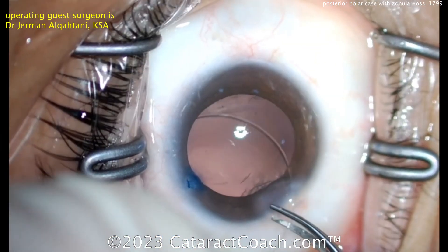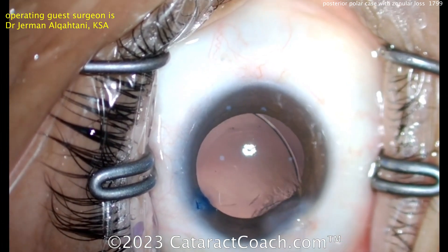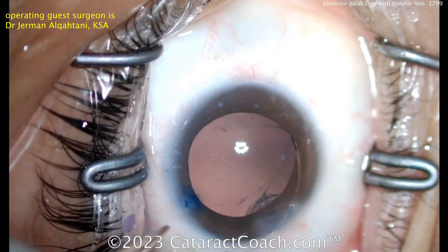You could just put a single-piece lens in, but it would probably not do well. I like the idea of a CTR — a capsule tension ring — that goes in very nicely, and this is being manually inserted.